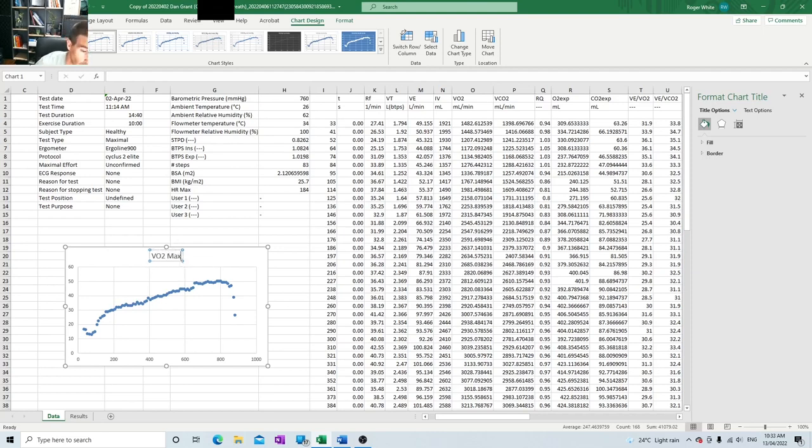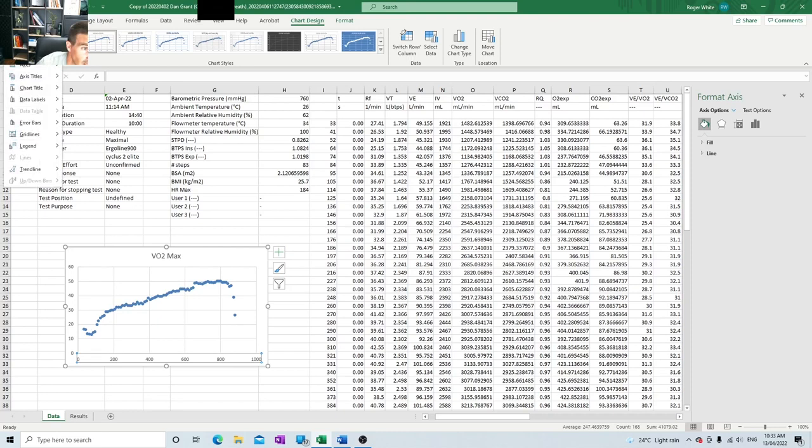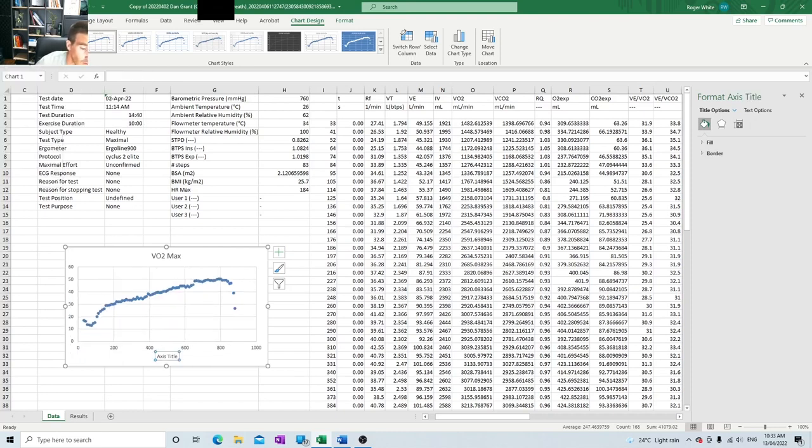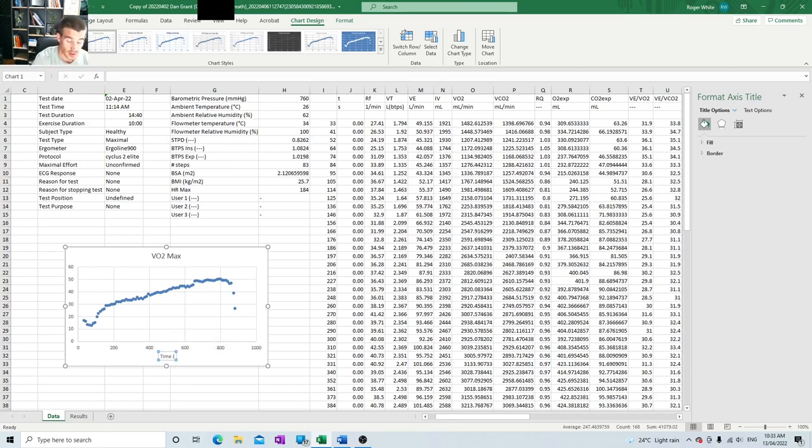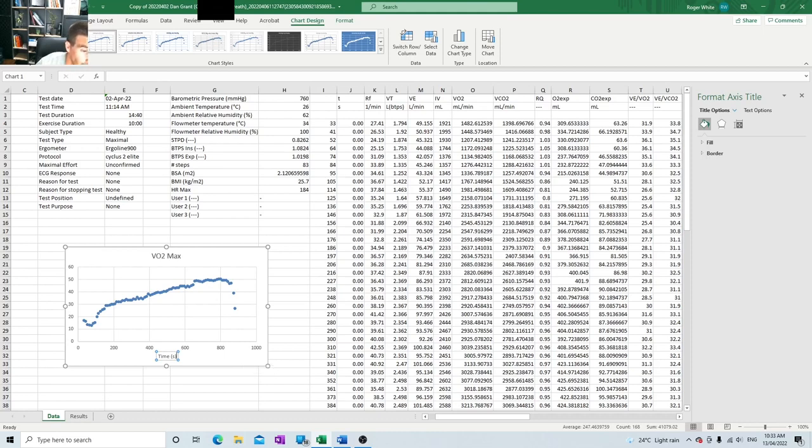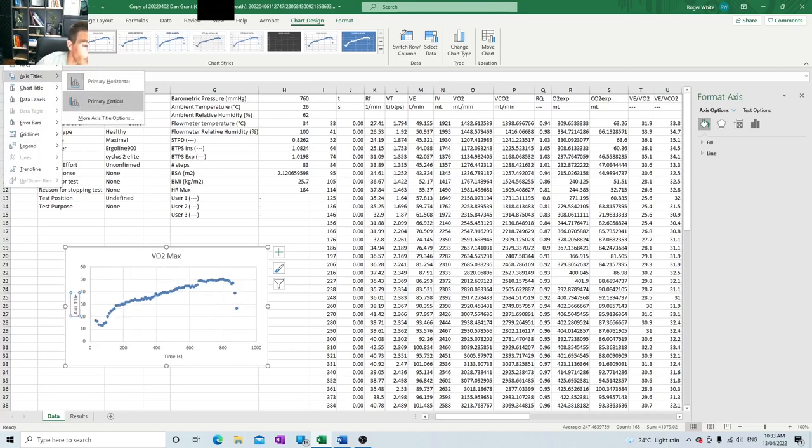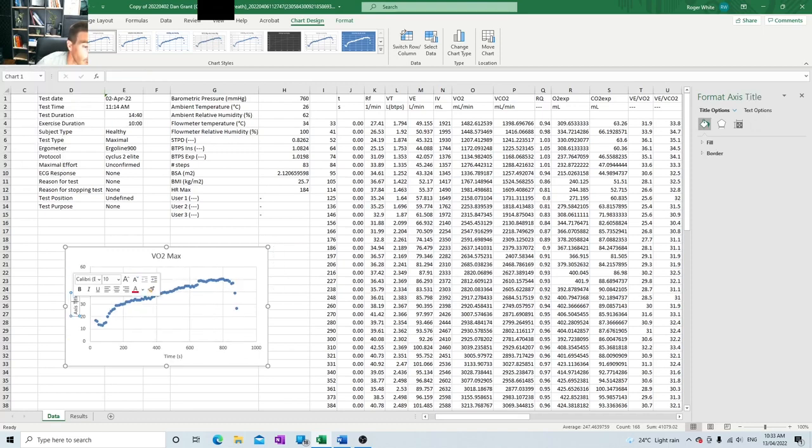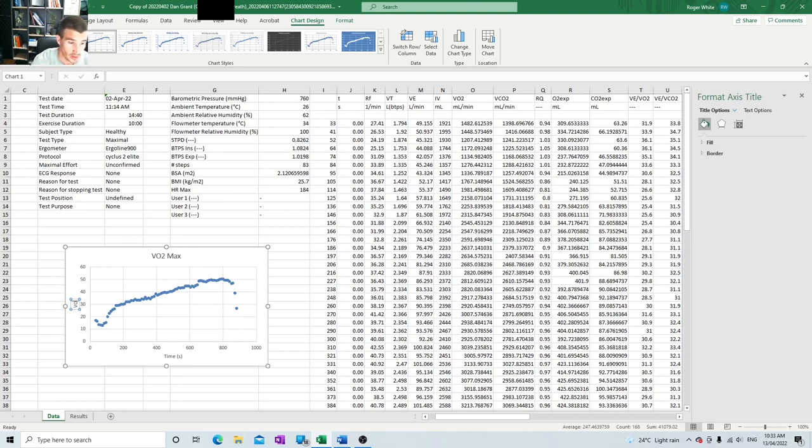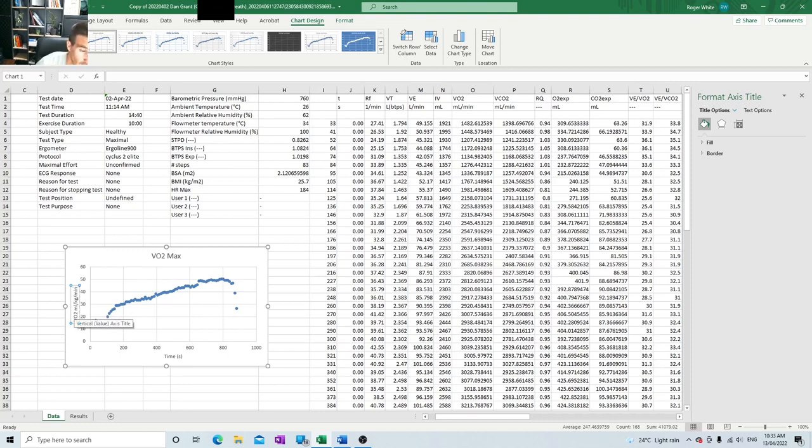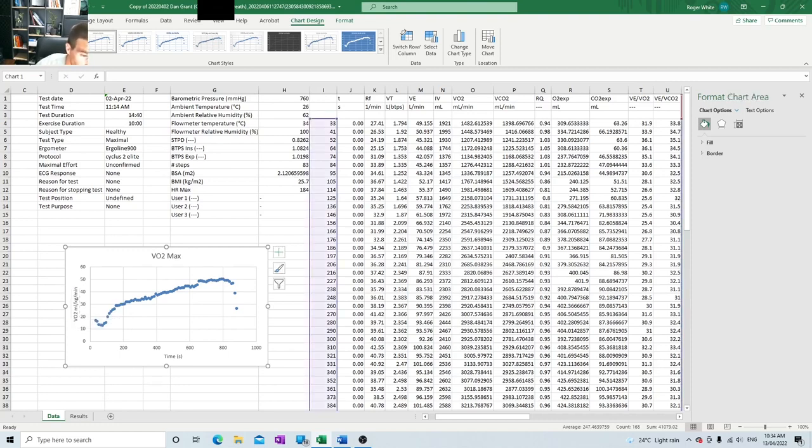Looking for their VO2 max, that's what we're looking for here. On this axis, we got add chart element, axis title, primary horizontal. Here, we're looking at seconds. So this is the time in seconds, which we can then use to compare against the power output later on. And then in this column, primary vertical, we have the oxygen consumption. So VO2 in milliliters per kg per minute. So we always put the units in there as well, because milliliters per kg per minute is very different to milliliters a minute. So this is the relative to the body weight score, which is what we generally look for with VO2 max.